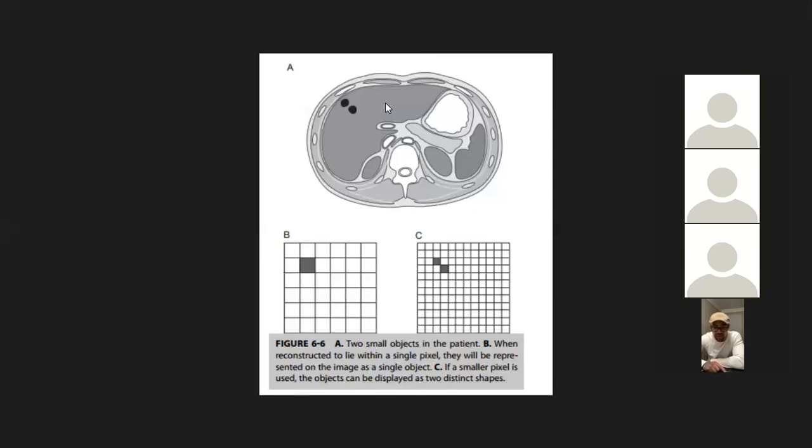Now, do you both have your content specifications printed yet? No, they're on my computer. All right. Make sure you get them. Danielle finally put them on the course shelf. When you go through and look for these concepts of high and low contrast resolution, you'll see it's not going to be a massive part of the test, but you need to understand it.